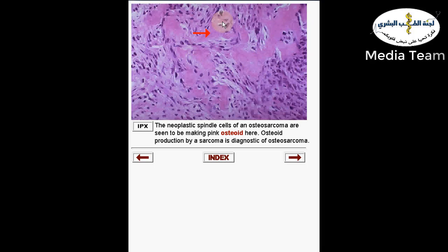They are not like the mature ones in shape. They do not resemble the mature osteoid trabeculae. They are very irregular, they are deposited haphazardly, they do not have any specific arrangement. In addition, at the edges of this osteoid material, we have the malignant tumor cells that deposit this material. The tumor cells are hyperchromatic, pleomorphic, and abnormal looking.